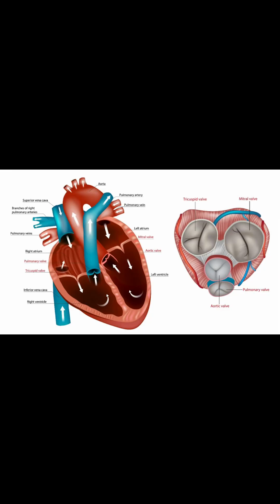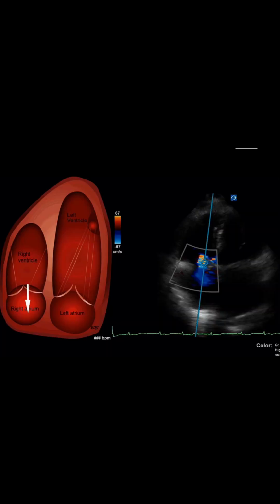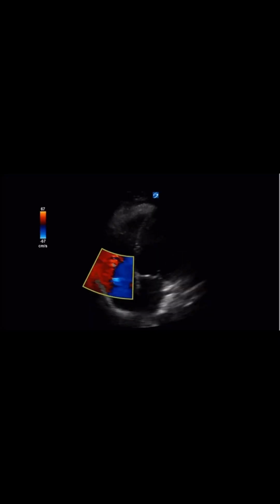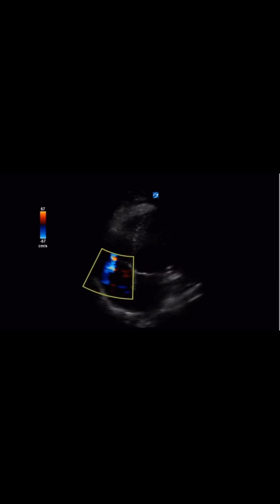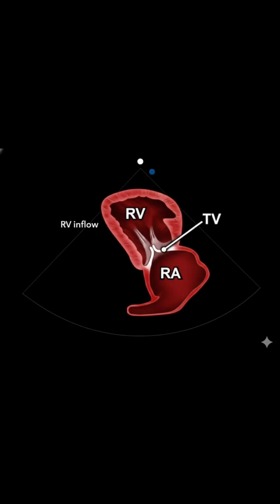I'm Dr. Angela Hafizi Ruff, and today we are shifting our focus from simple metrics to integrated right heart hemodynamics, the cornerstone of assessing cardiopulmonary disease. We clearly visualize the right atrium (RA), the primary reservoir of systemic venous return, leading directly into the right ventricle (RV) via the tricuspid valve (TV). This is the foundation of our systemic circulation and a critical determinant of patient prognosis.